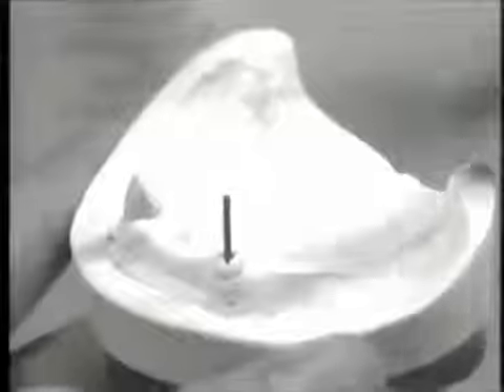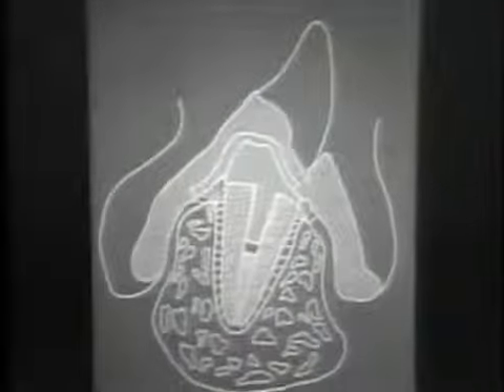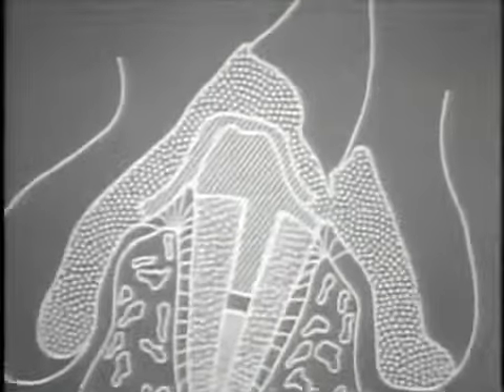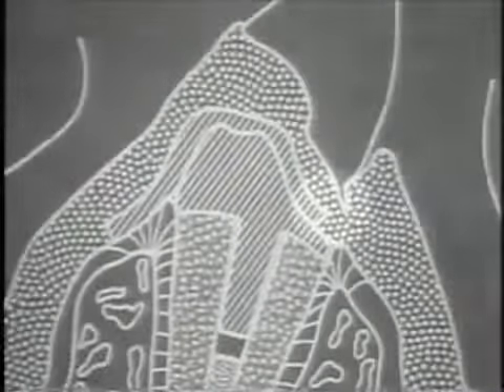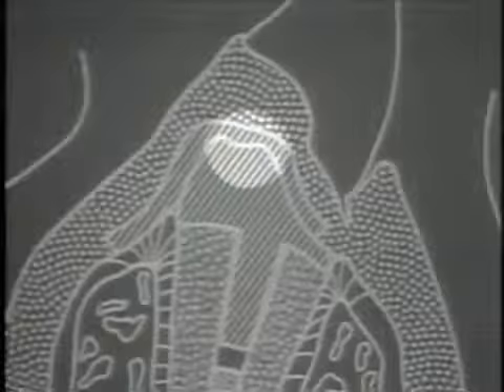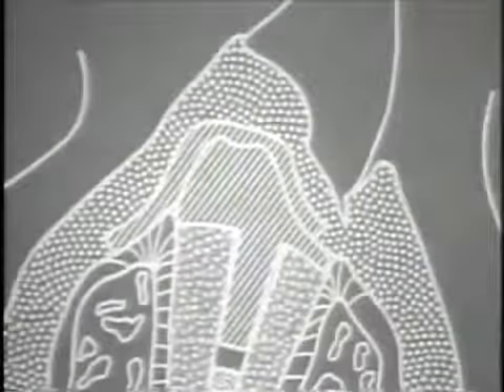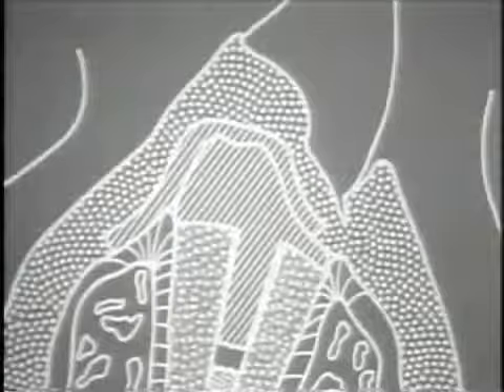After lubrication of the prepared post hole, the Parapost burnout post is positioned to its full extent. Incremental additions of casting wax are added to develop the coping contour. The coping is waxed with a labial concavity to accommodate the cervical portion of the artificial denture tooth placed in the denture. Additionally, an occlusal countersink or dimple is placed in the coping, which provides a definite key for the overdenture under basal loading and helps to resist buccal-lingual or mesial-distal displacement.